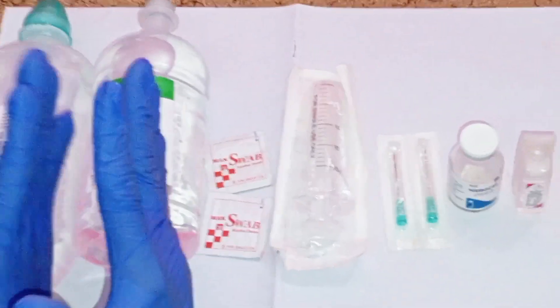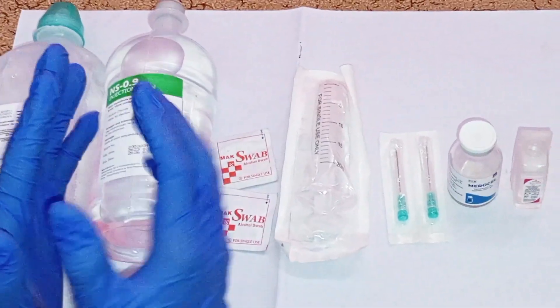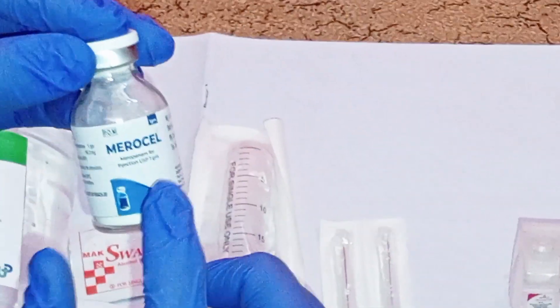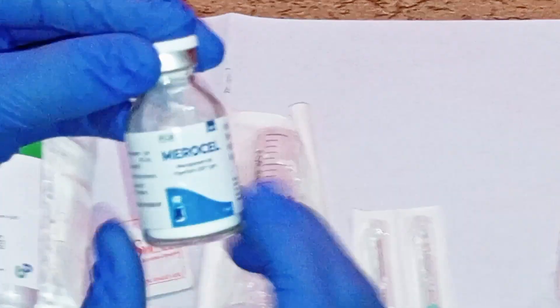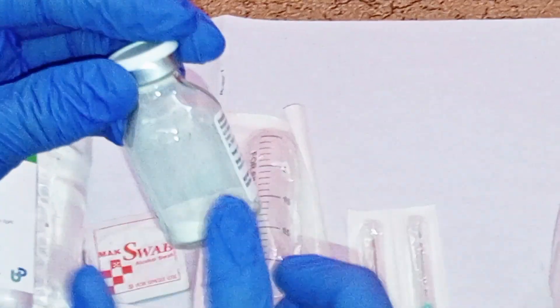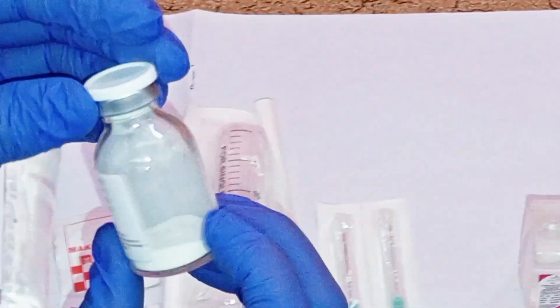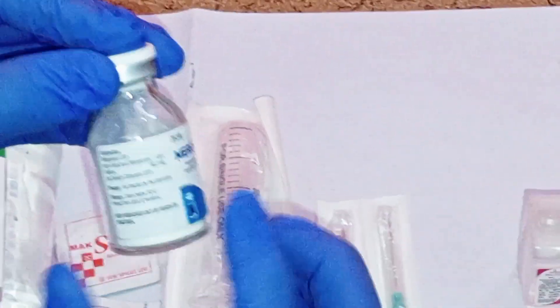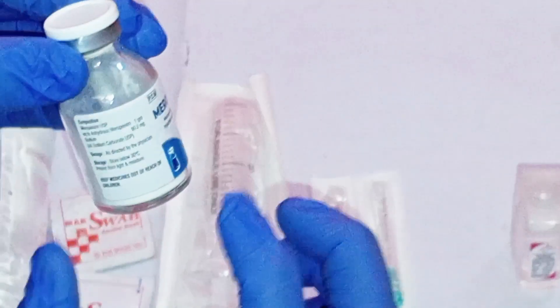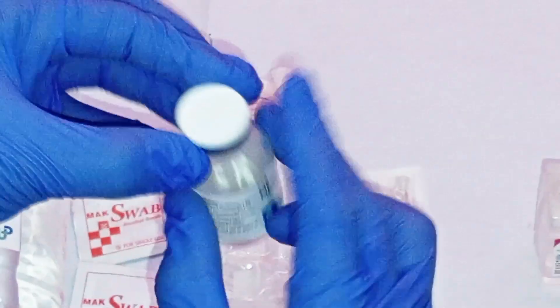Welcome back. In today's tutorial I'm going to show you how to reconstitute or dilute meropenem for injection. This is meropenem for injection — it is an antibiotic used to treat bacterial infections, especially of the skin or the abdomen. It works by killing bacteria or inhibiting their growth.